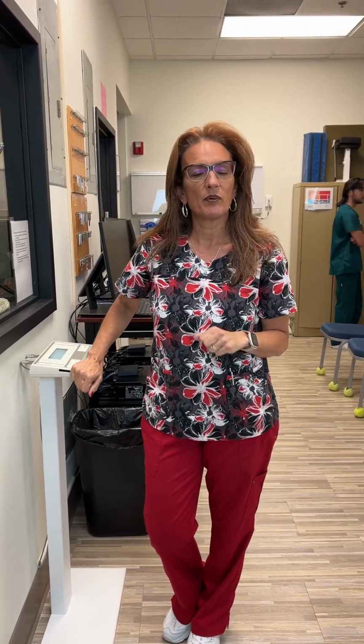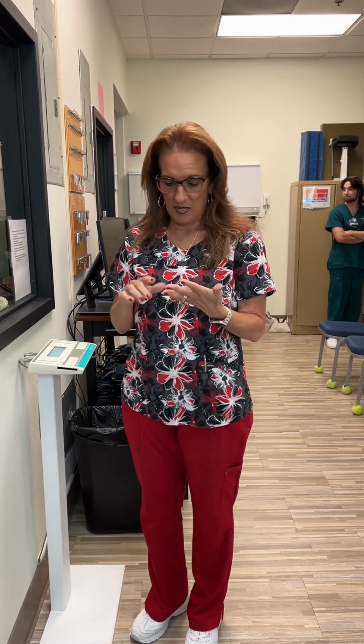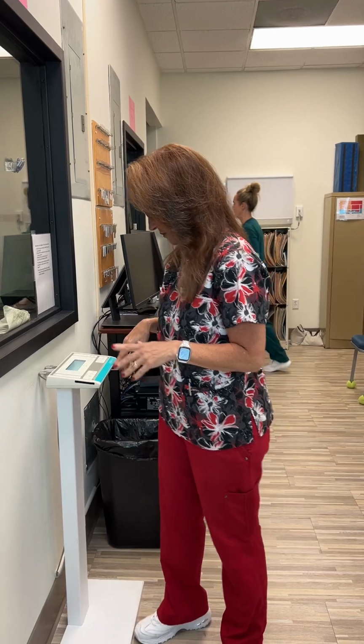All right, so today we're going to show positioning for an AAS. Sometimes they refer to that as a three-way abdomen. It's basically one view of the chest and then two views of the abdomen, one upright and one supine. So what we're going to do is set everything up first.